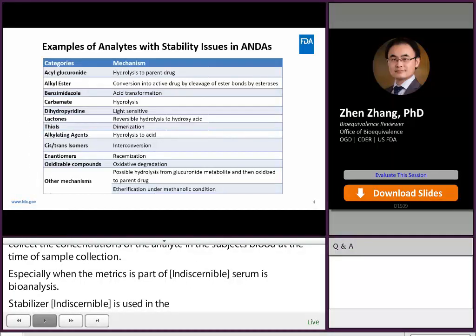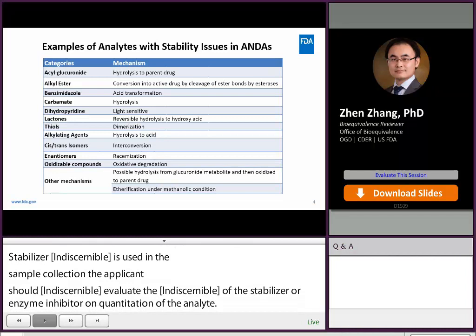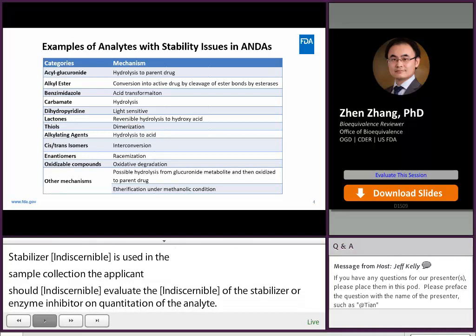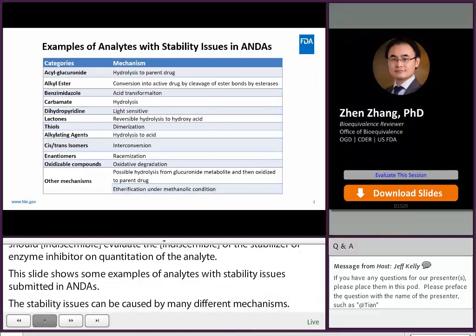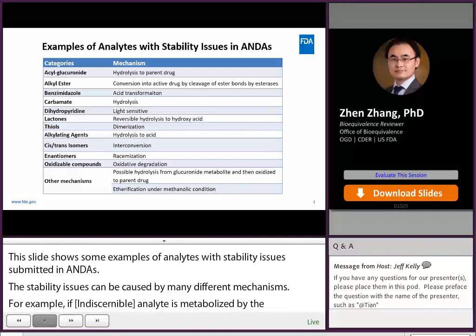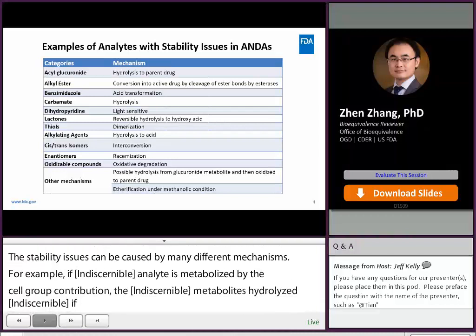This slide shows some examples of analytes with stability issues submitted in ANDAs. The stability issues can be caused by many different mechanisms. For example, if the parent analyte is metabolized by acylglucuronide conjugation, the conjugated metabolites may be hydrolyzed back to the parent analyte if no precaution is taken to stabilize acylglucuronide conjugated metabolites. This back conversion may lead to overestimate of the parent analyte concentration in study samples.